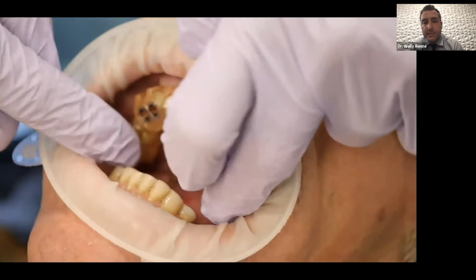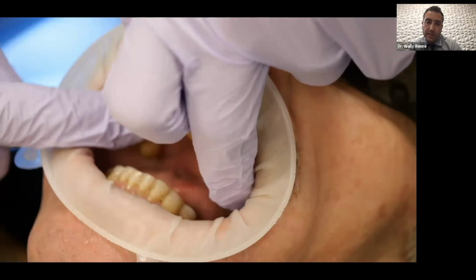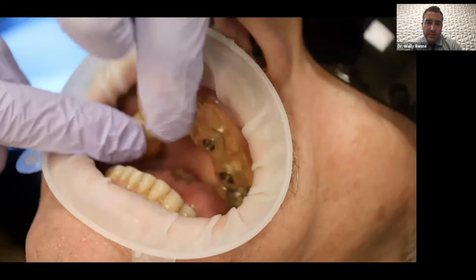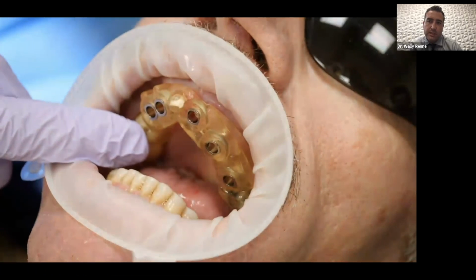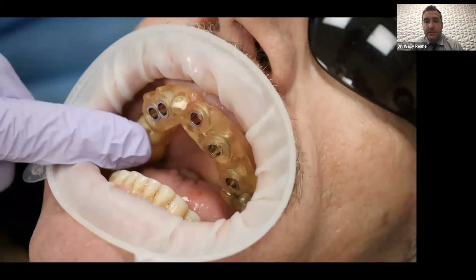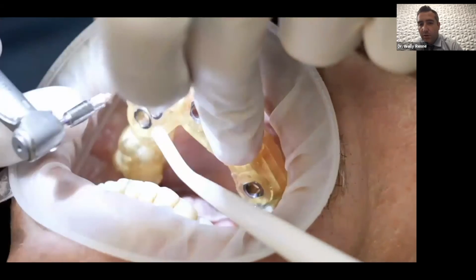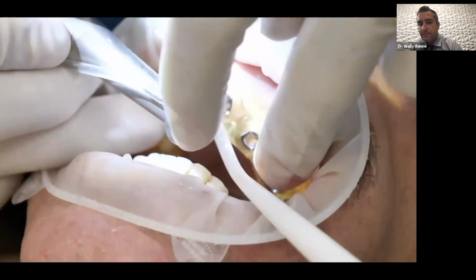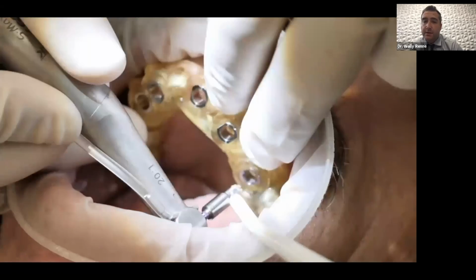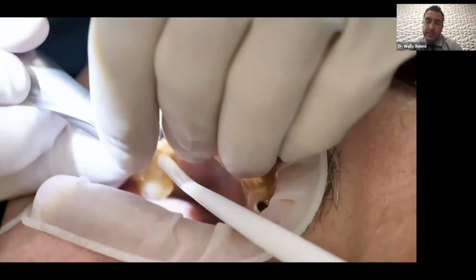And now we're on the day of surgery where we're placing this now. This is a tooth-borne surgical guide. And Dr. Evans here now is going to be surgically placing these implants. And by the way, it's kind of not fair because the whole appointment took him 30 minutes, from patient first sitting down in the chair till implants are placed.